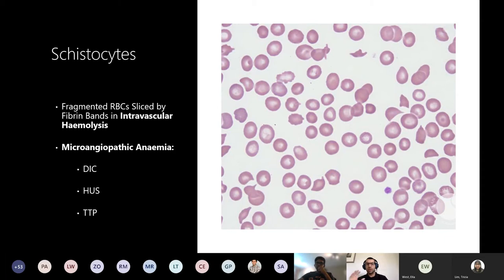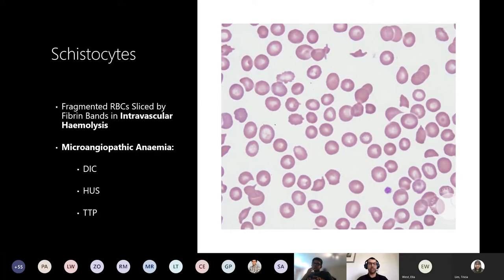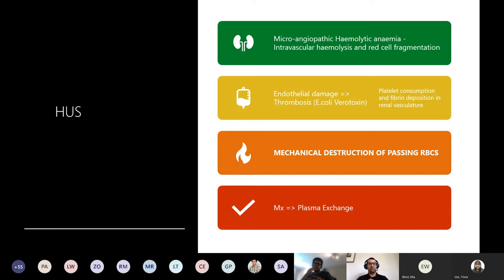Very well done - the majority got it right. These are schistocytes. When looking at a blood film it's important to look at the shape of cells, the color, and how many there are. Schistocytes are red blood cells that have been sliced into really small fragments - like a pizza cut by fibrin bands. The most common cause is intravascular hemolysis, specifically microangiopathic anemia. With the presentation of possible renal failure, bloody diarrhea, and abdominal pain, the most likely cause here is HUS.